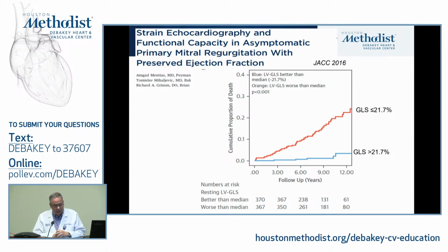Okay, now, mitral regurg, same story, but notice the cutoff. Completely within normal range. Well, with EF, it's the same story, right? Less than 60 is trouble for mitral regurg. So again, it's a lesion that has a high preload component, lower afterload because of the leak in the mitral valve, and we use higher threshold for EF, and lo and behold, higher threshold for GLS.